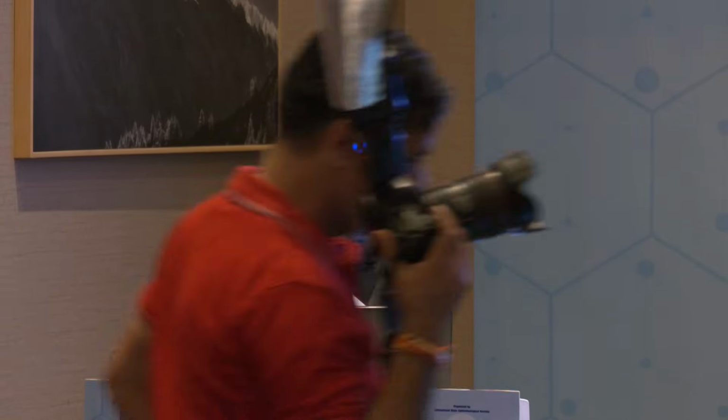Okay. As you all know, chromovitrectomy is a very important topic. There is a very beautiful saying that the eyes see only what the mind knows. So these are the headings. Before we start, it's very important to know some of the terminologies used in chromovitrectomy. What is a dye? A dye is a chemical agent which binds to and induces color. A vital dye is a substance which induces color in living tissues. Intravital staining is the staining of living organisms, but supravital staining is staining when the tissue is freshly removed from the body.